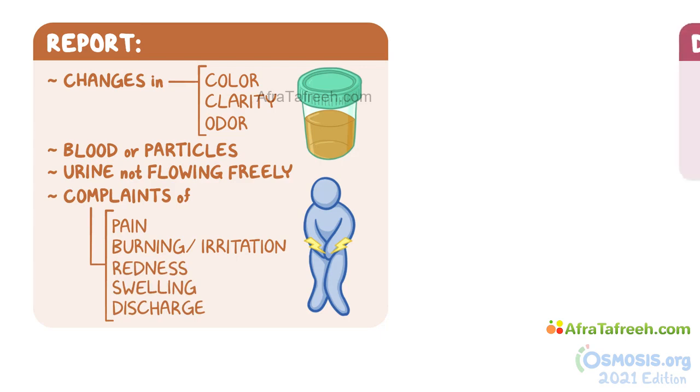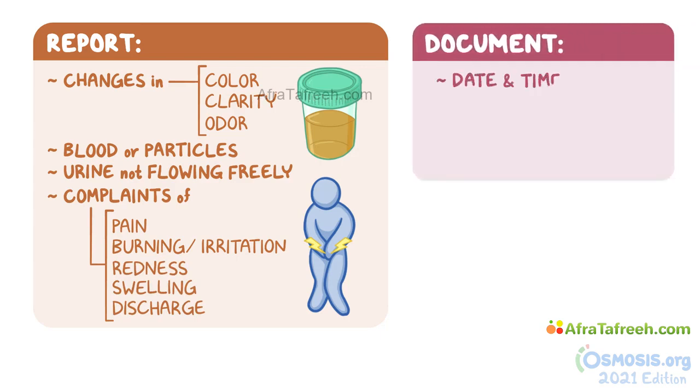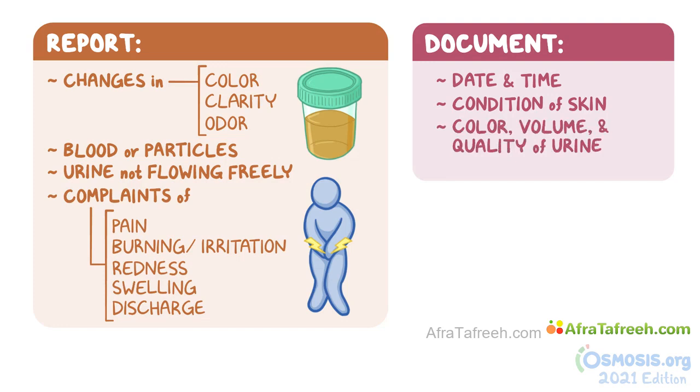After both types of procedure, make sure to document the date and time, as well as additional details of the procedure, like the condition of the skin after routine indwelling catheter care and the color, volume, and quality of the urine after emptying a urine drainage bag.